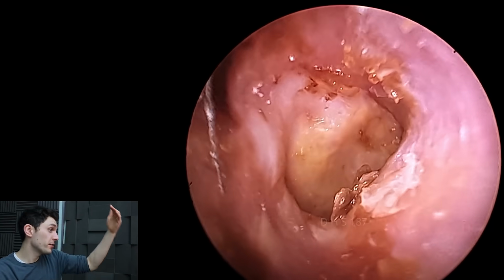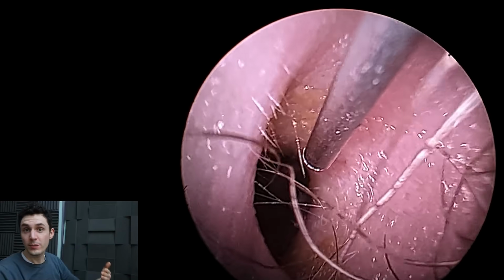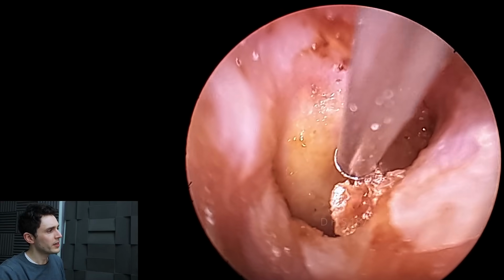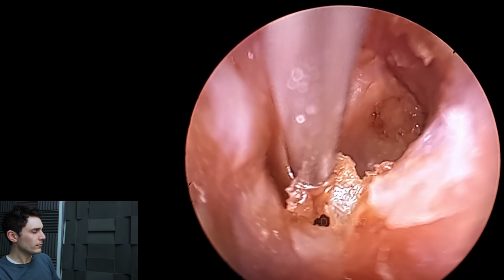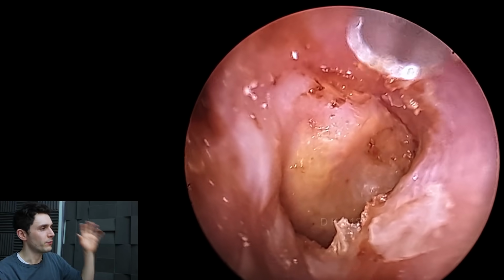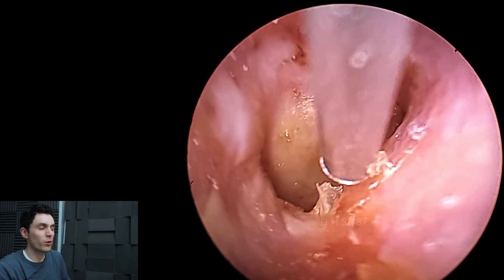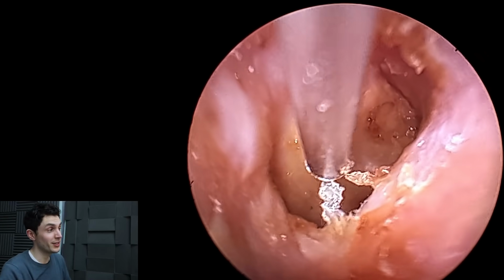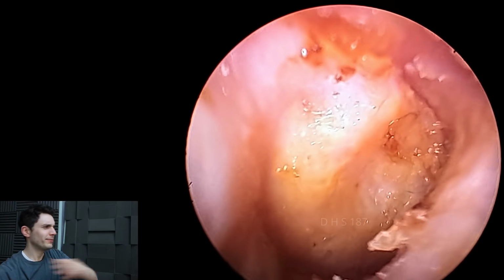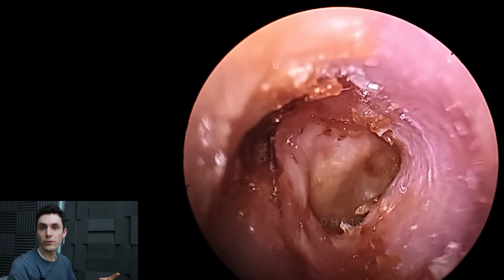But again, I rather suspect that it looks kind of dull and featureless because, again, it's got that neotympanum over it. So we're just going to tidy up a little bit of this dead skin and see if we can't improve the situation. But again, we're going to leave it up to the general practitioner doctor. Patient, it's probably not a bad idea to apply the medicine in this ear as well, but we'll let the doctor decide. So as you can see, it's not that lovely greyish blue colour.